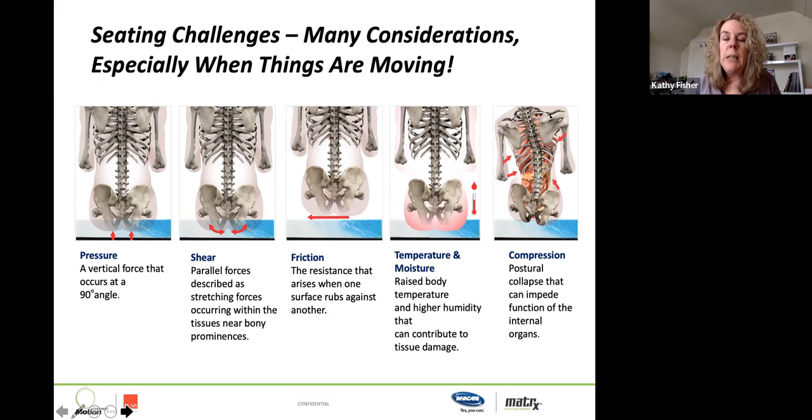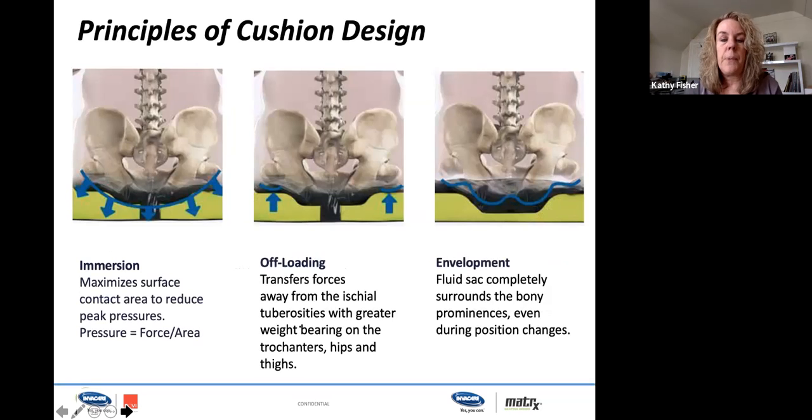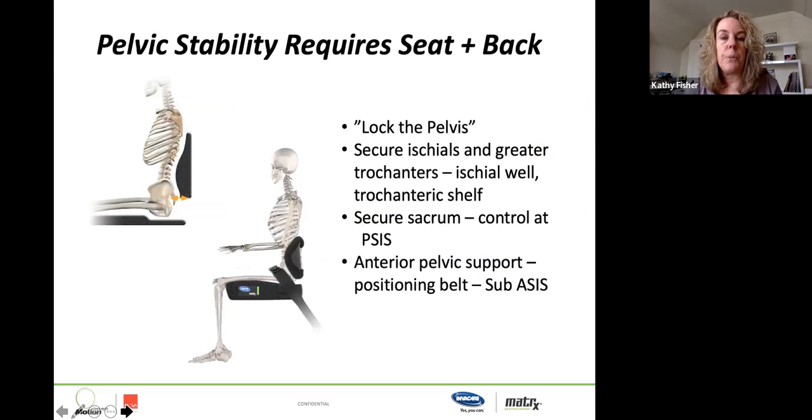Okay, it gets really interesting and complicated when things start moving. So again, we need to be aware of all these things and the benefits of powered seating. But again, thinking about the introduction of shear forces when we add recline. And when we see Stephanie, hopefully she'll join in and talk to us about the implications of shear and of friction and those types of things. Again, we need to think about the design of our products and how they are designed to be used. And if we're looking at multiple positions, how are those forces being translated as somebody moves, and how are we managing skin and posture.